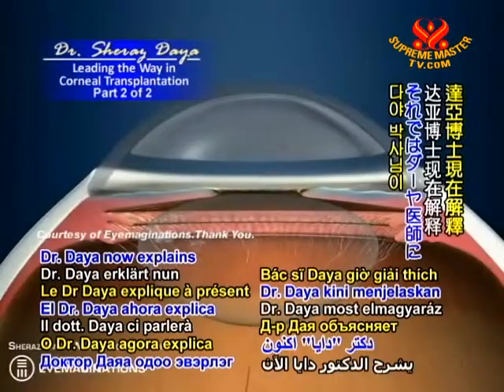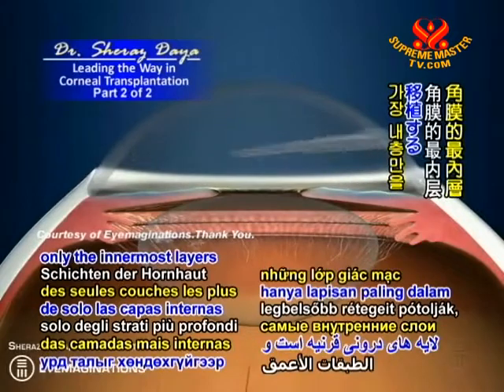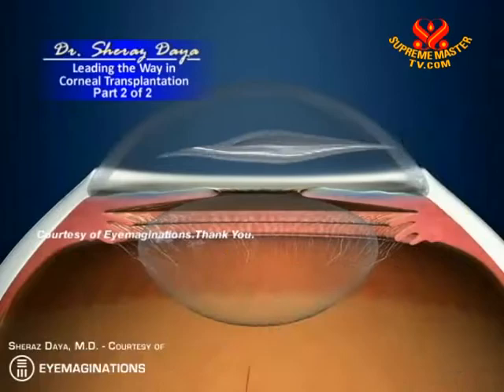Dr. Daya now explains a newer technique which involves replacing only the innermost layers of the cornea while keeping the anterior intact.